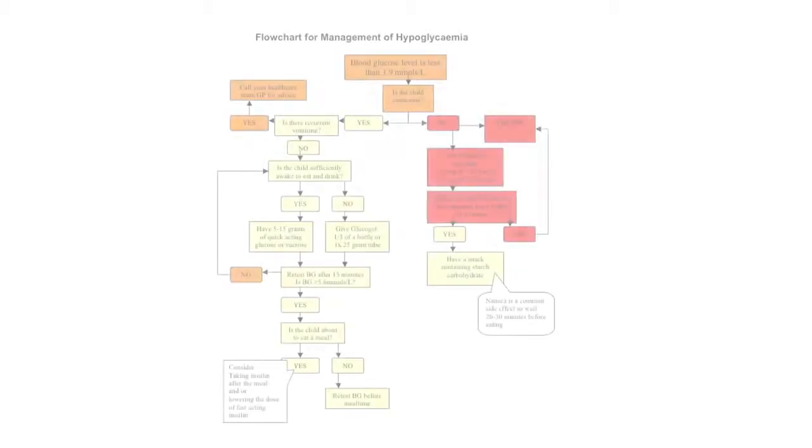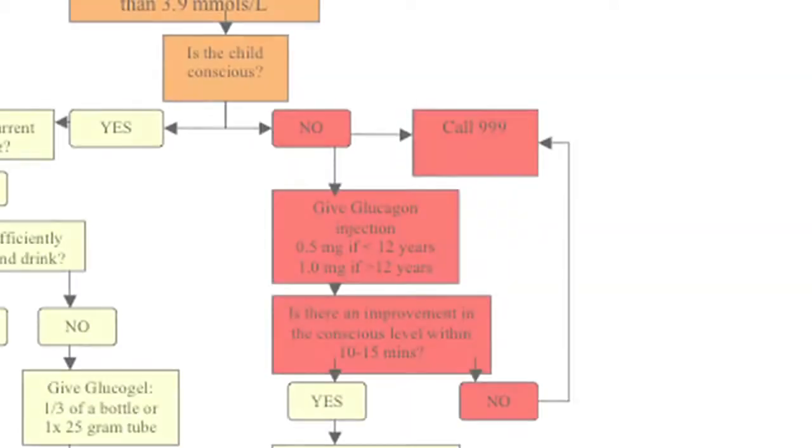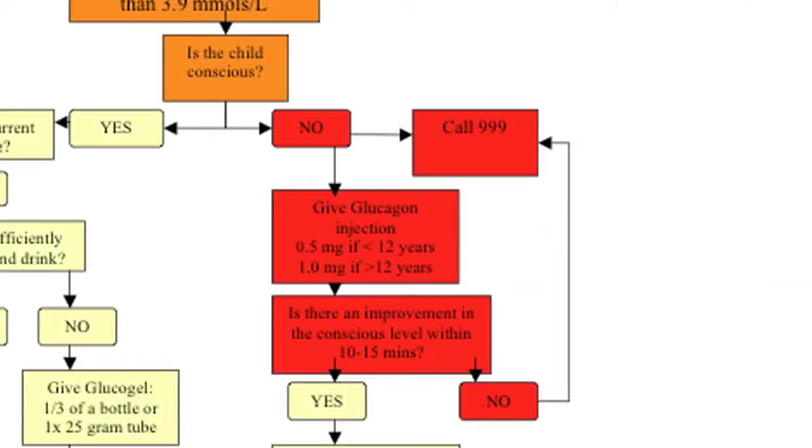Now you may feel a little bit unclear about when you might use this, and we have a flow chart really clarifying at exactly what point we'd recommend using a glucagon injection on our webpage. This is an emergency situation, so we would suggest that if it's possible, someone rings 999 while somebody else gives this injection, and that way you know you've got backup coming to help you should you need it.